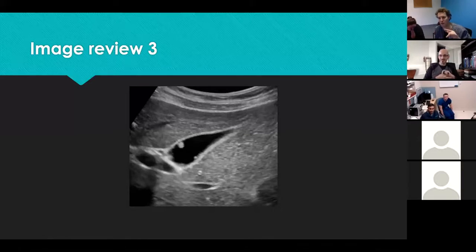For the ICU DDU, it's always a stem, and then anywhere between 1 to 10 images you'd have to review. So I think it's very similar. Absolutely, clinical context is a really important part of analysis. Oh, perfect. You're absolutely right. I think for the next time, I might change them in a way that I put some stem to them as well.